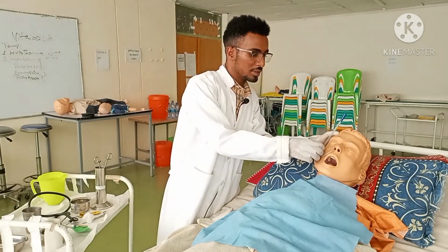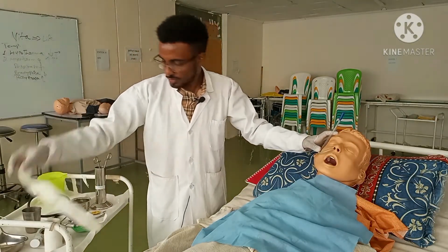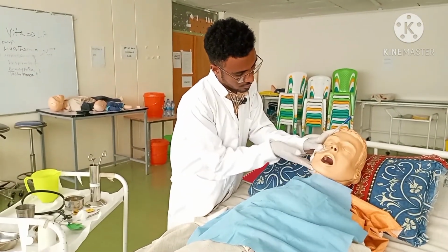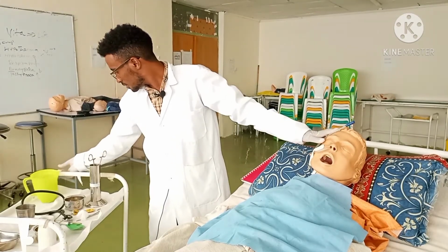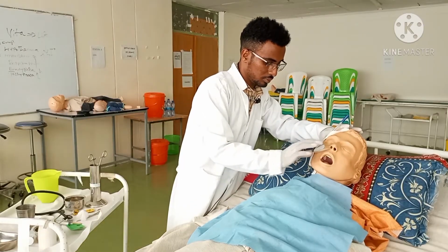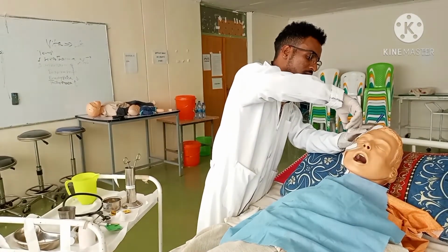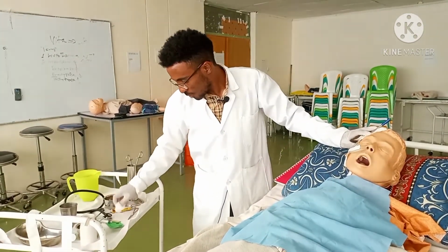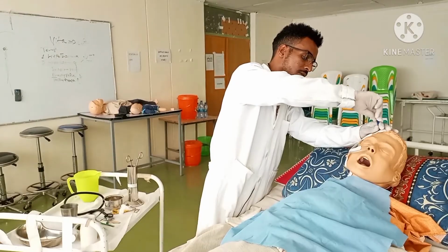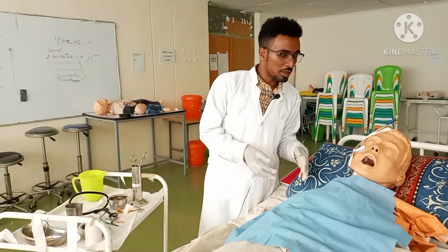After that, you have to tape the tube. Tape the tube in place. If there is any gastric juice fresh here, you can clamp here, or you may use the tip. You may close the tip. I have already secured the tube in place.